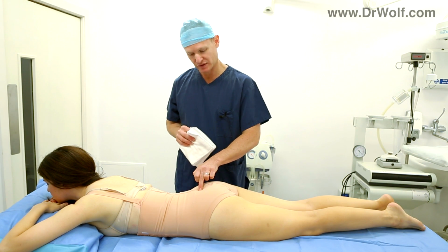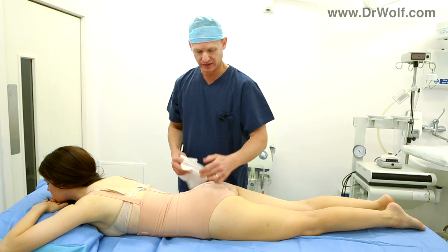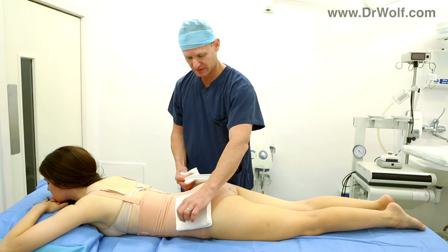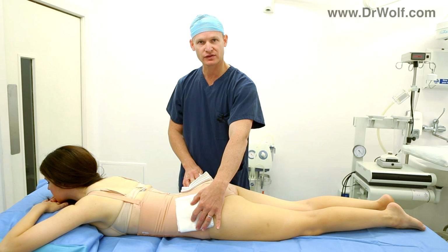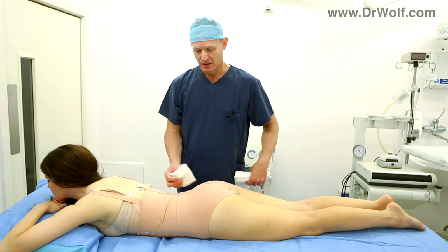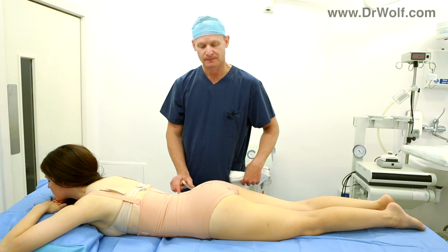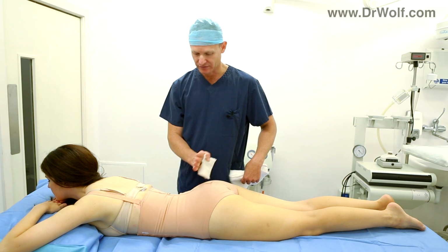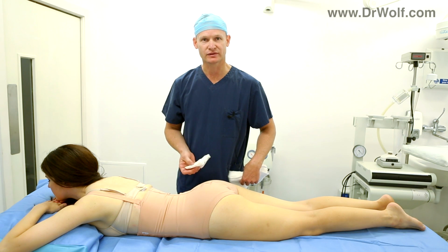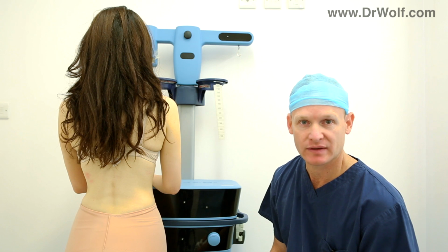I'm going to show you where the access points for the flanks are. I generally place 1 just above the buttocks crease, and then 1 on each hip. These again are in the underwear line, so they're not visible at all. The padding is placed into these positions for the first 24 hours, and then can be replaced by these smaller pads. In the case of the back, I often apply a thicker padding or a piece of foam that will just give you the nice contour of the lower part of the back, which really sculpts that out, so it's important to wear that.